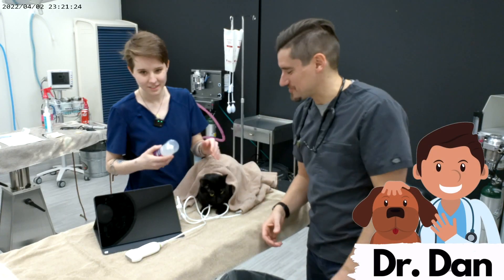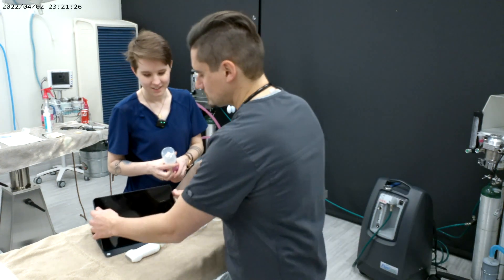Hey guys, my name is Dan, I'm a veterinarian. Today I'm gonna show you, as a veterinarian, how I go about getting urine from a cat.